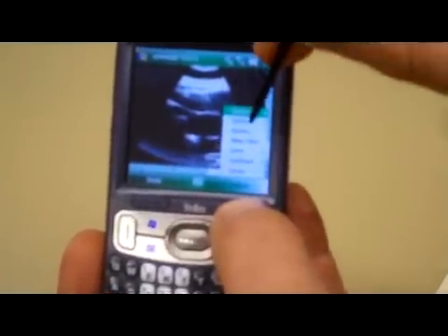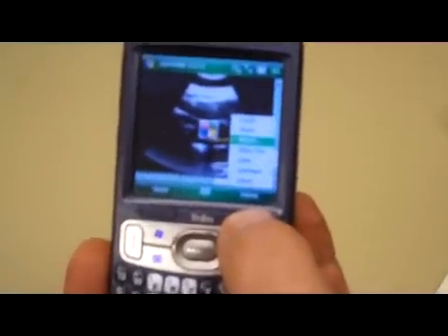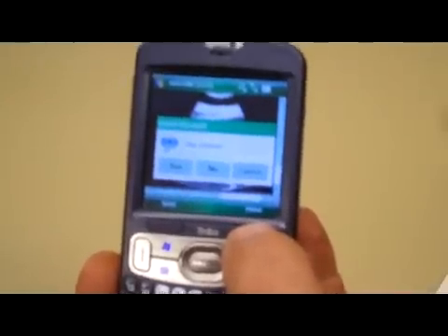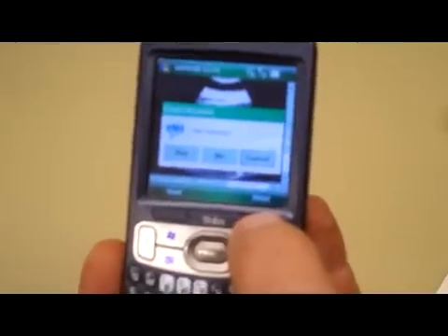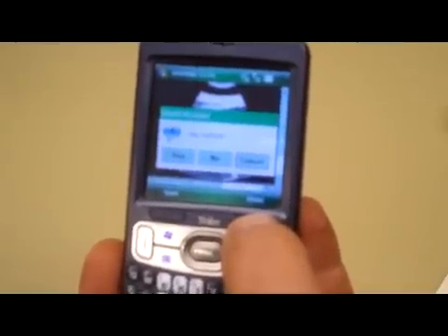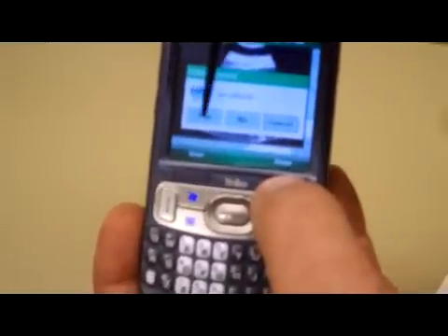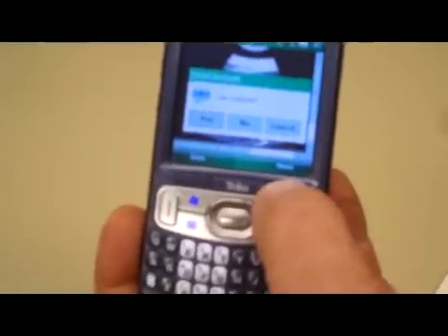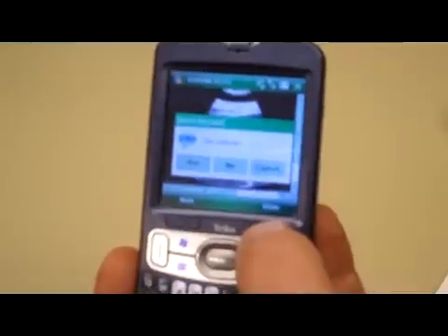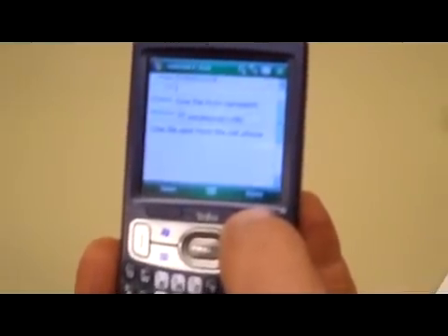You can freeze and send when you activate the phone, or do it when you sync. This will automatically send and ask about Outlook. If you activate the phone and set it up with a separate non-Outlook email account, you would say no. If you say yes, it'll use the Outlook mail account you've set up. If you haven't set one up, it uses the default. It takes a minute to save the file and get all the email settings.